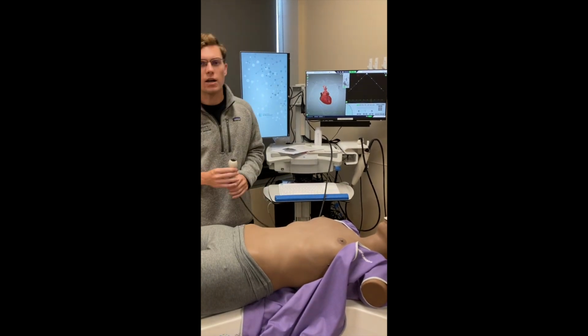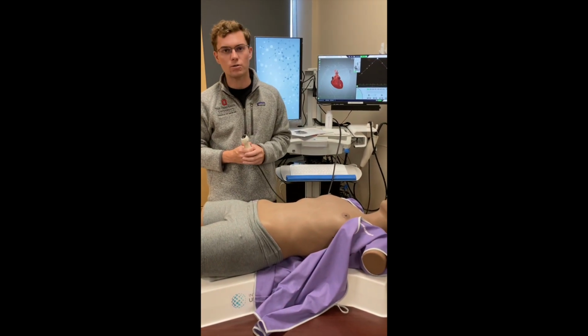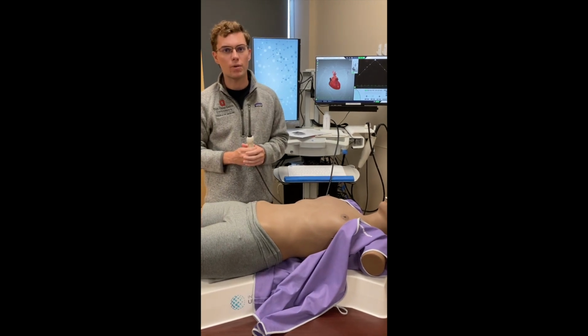And then with any additional time, you can run through different imaging of the heart, like parasternal long axis, short axis, apical four-chamber, or you can play around with the Eve a little bit, with different pathologies and physiologies.